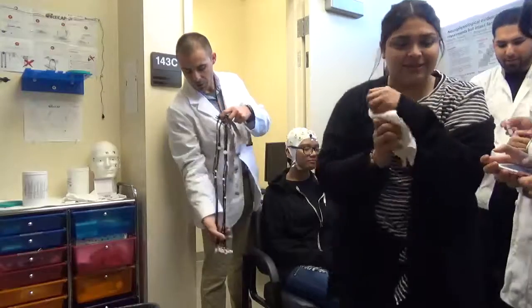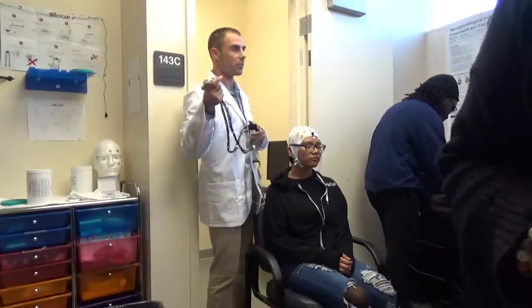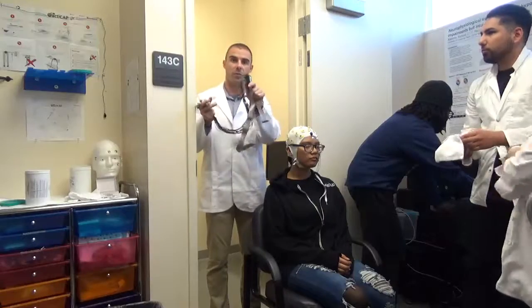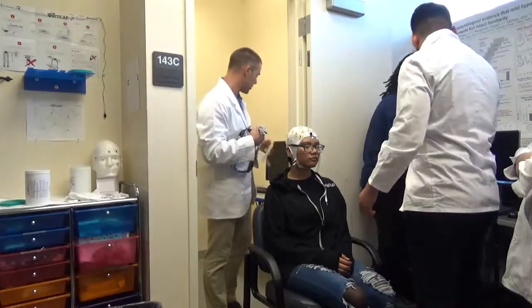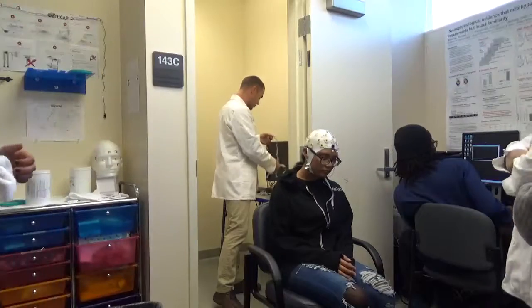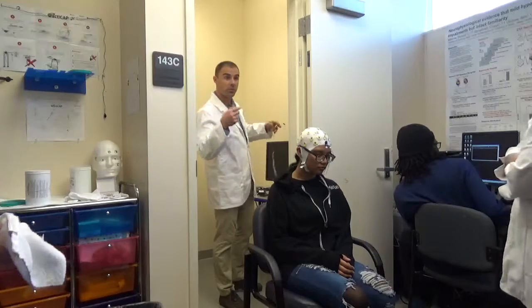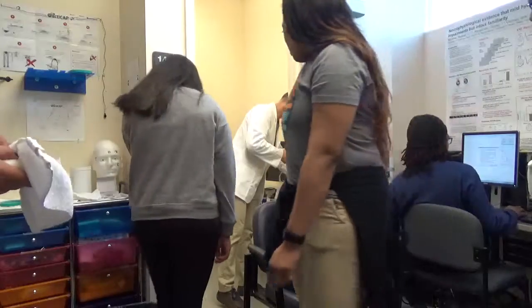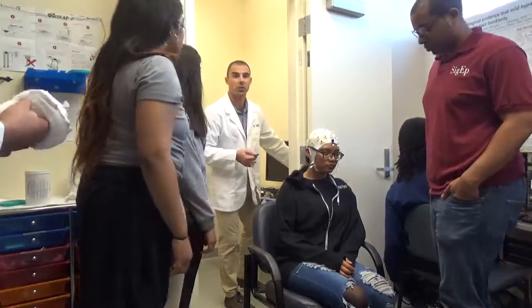Alright, so let's take a look here. Now we have all of our electrodes. Very sensitive, expensive, delicate. You have to be very careful with them. Of course, the most delicate parts are the back end and the middle end. There's a little connector back here, and if you guys want, you can come back here and see how we plug this in. There's some equipment back here you might want to see.